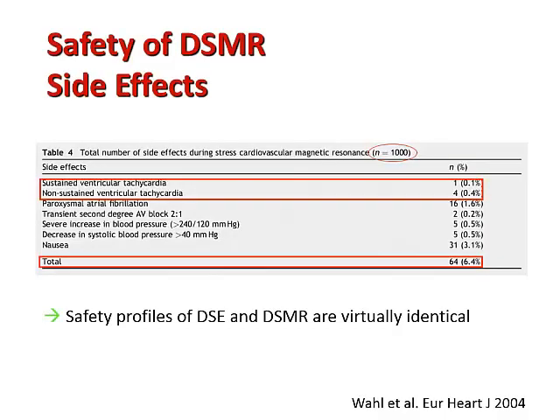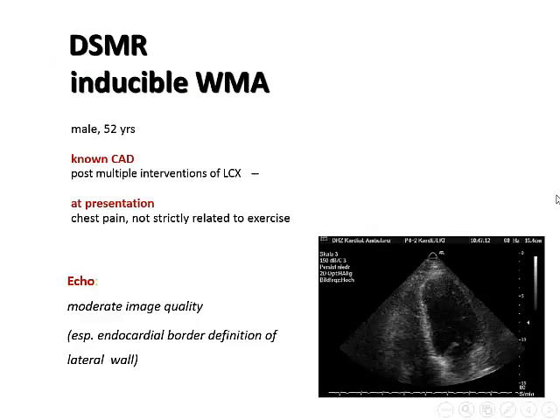What about the safety of the dobutamine stress MRI? It has the same safety profile as the dobutamine stress echo. I would like to show you a couple of examples of the dobutamine stress MRI.